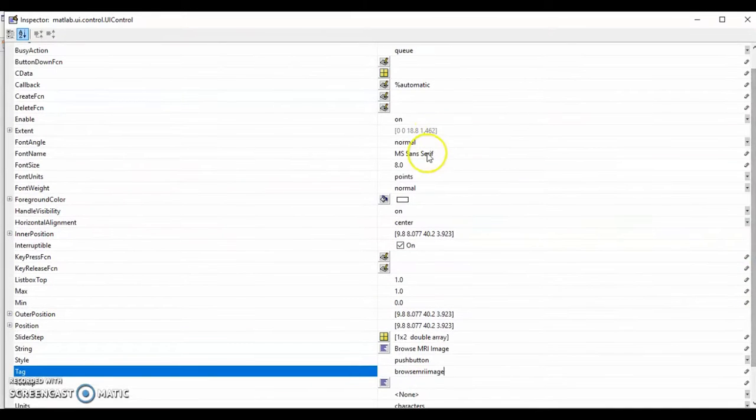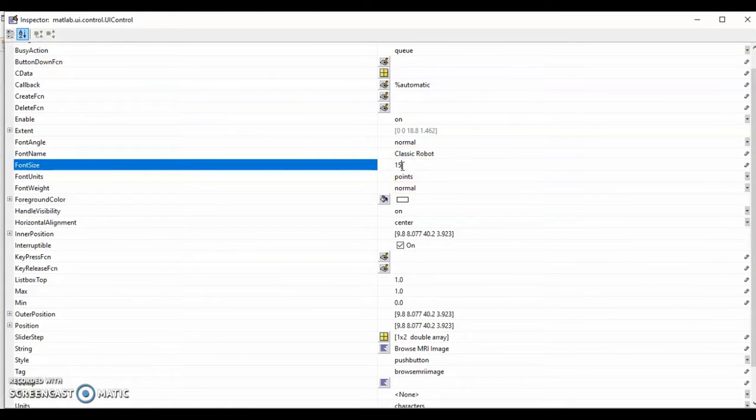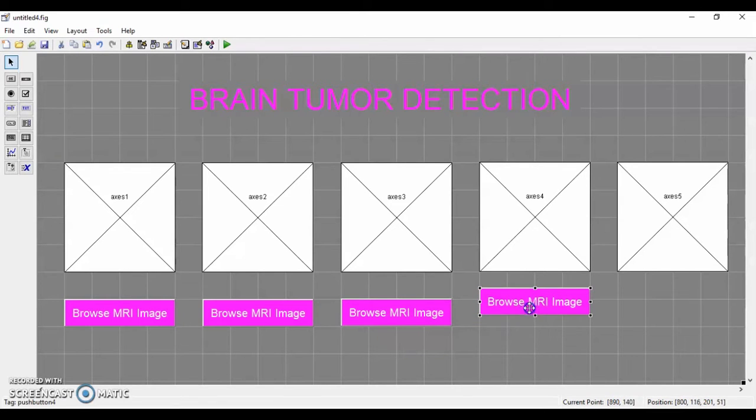So we can also change the font style and font size. So in this case, we will use classic robot and also 15 font size. Next, we will copy and paste the push button according to the number of push button we need, which is 5 in this case. And next, we will change the title of each of the push button.